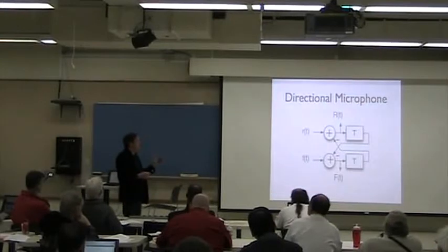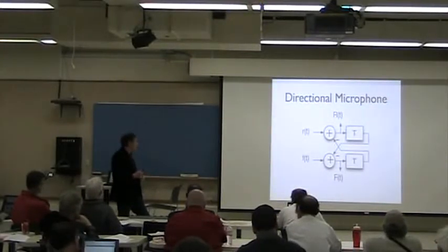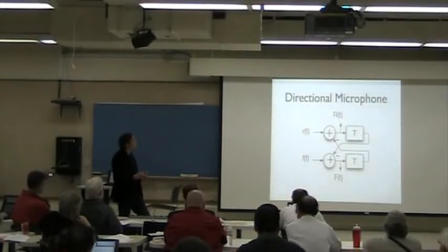So yes, it's not a part of the cochlea damage compensation, but it's a very important part of the device, and this is how we do the directional microphone.